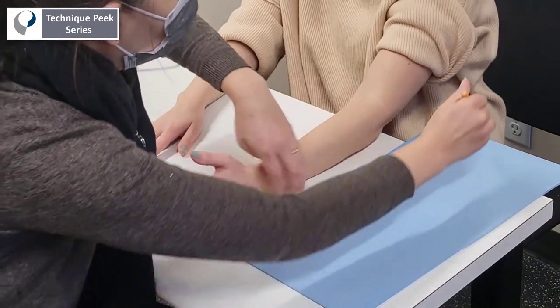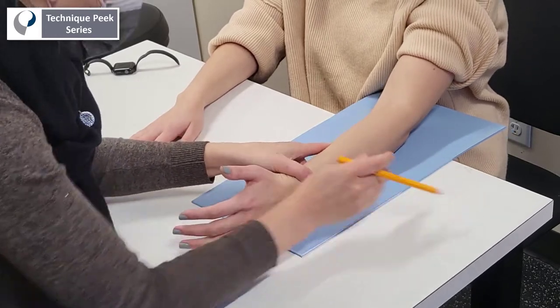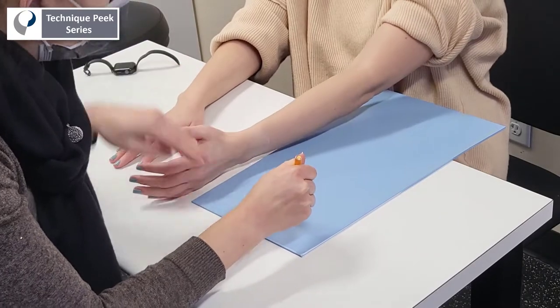Mark the posterior aspect of the elbow and create a U-shape to be able to clear the elbow crease during splint fabrication. Lastly, mark the CMC joint to create a small circle for the thumb hole.